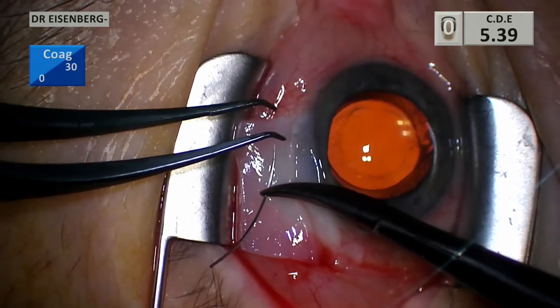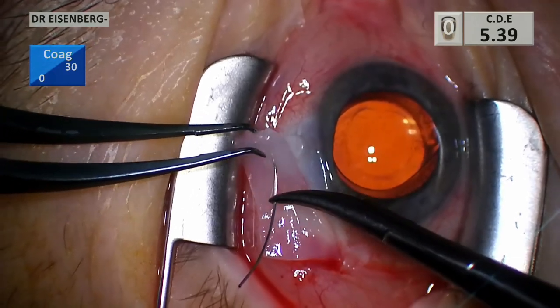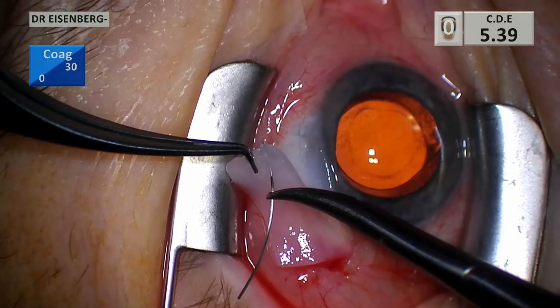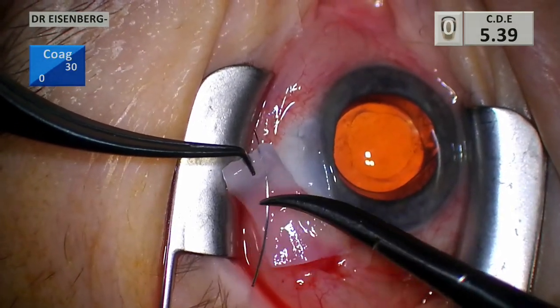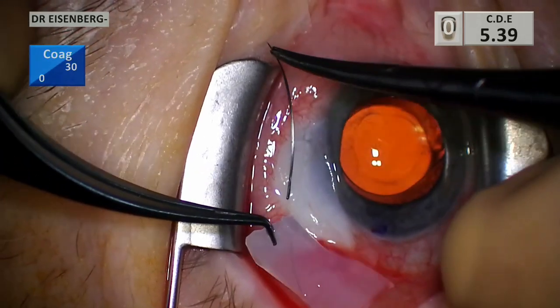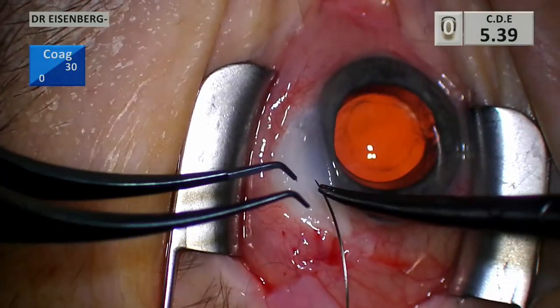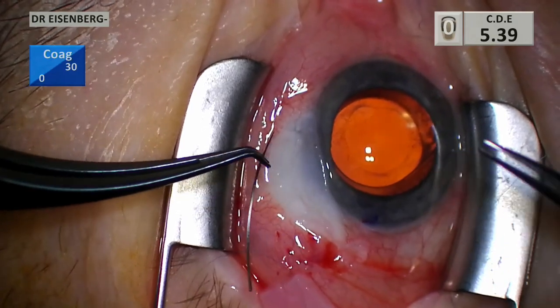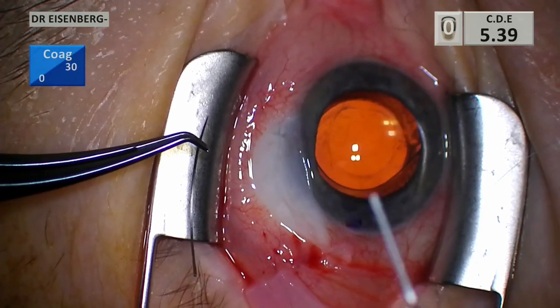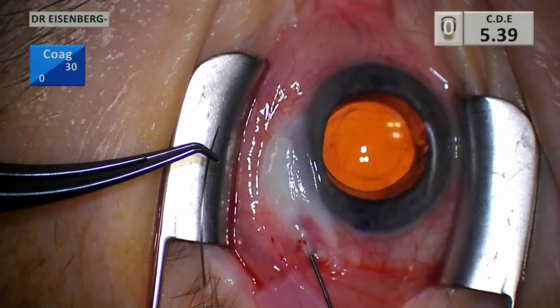Here what you're seeing me do is threading this through the thickness, going posterior, and I'm going to do that with both needles. This is a 10-0 prolene that I keep double-armed. It's certainly possible to do this other ways — you could come through the bleb first and go up, over, and back down — but I find getting through this tissue is really difficult, so having two sharp needles that haven't been used before is extremely helpful.